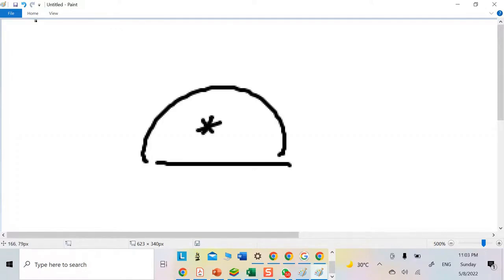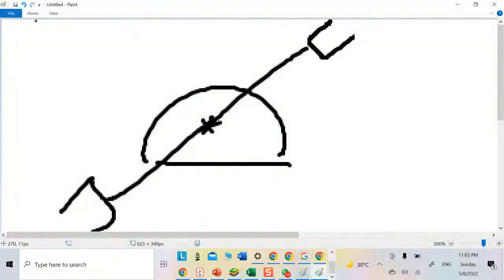The ligand, or the thing that produces the positron, where the positron is, if everything is going ideally, a photon moves like this. A photon moves like this. The crystal gives me the image. Everything looks good. There is no problem at all. But what is happening? The photon might have problems. As it exits, it might move in this direction and undergo Compton scattering, and it could be detected in that upward direction. This is likely to happen.